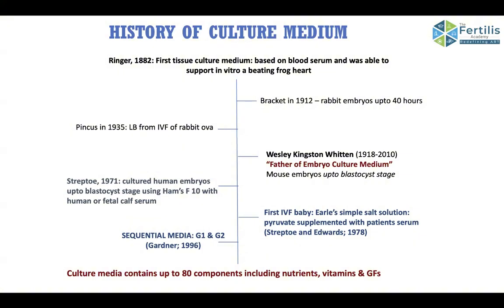But the first baby was born in Earle's simple salt solution, or as we call it, ESSS. This was supplemented with pyruvate and patient serum. Steptoe and Edwards cultured the embryo in this Earle's simple salt solution, which gave birth to Louise Brown, the first IVF baby.